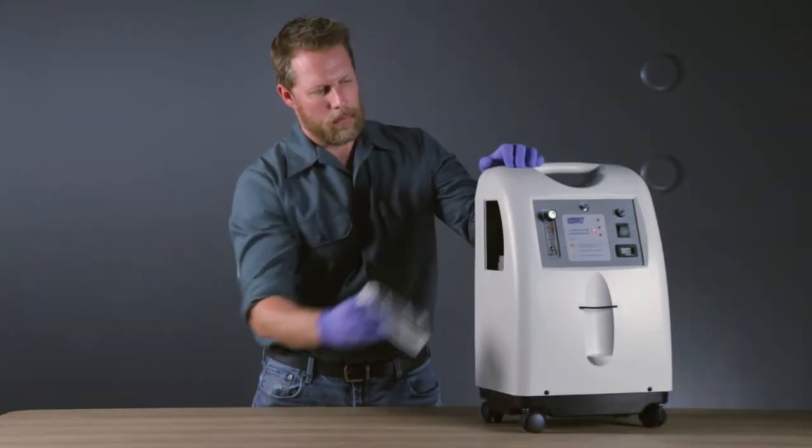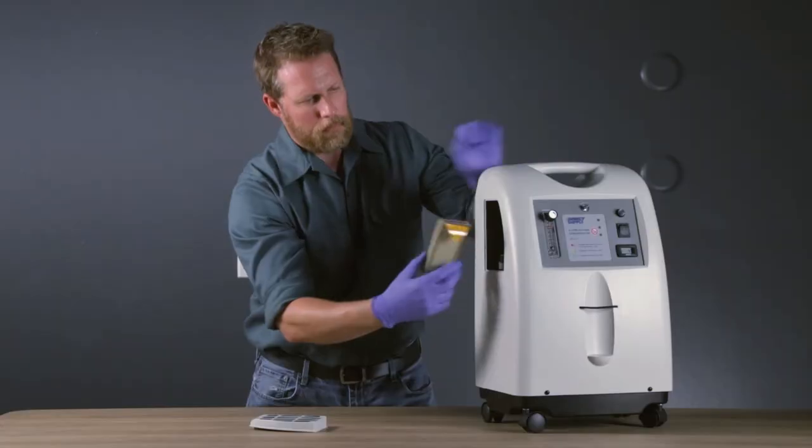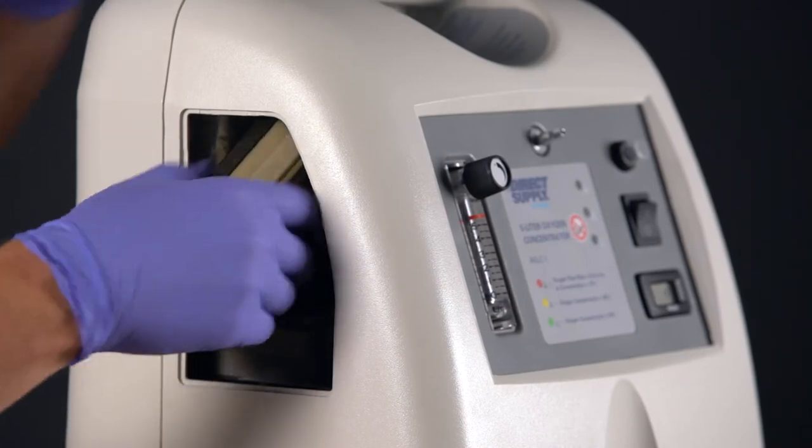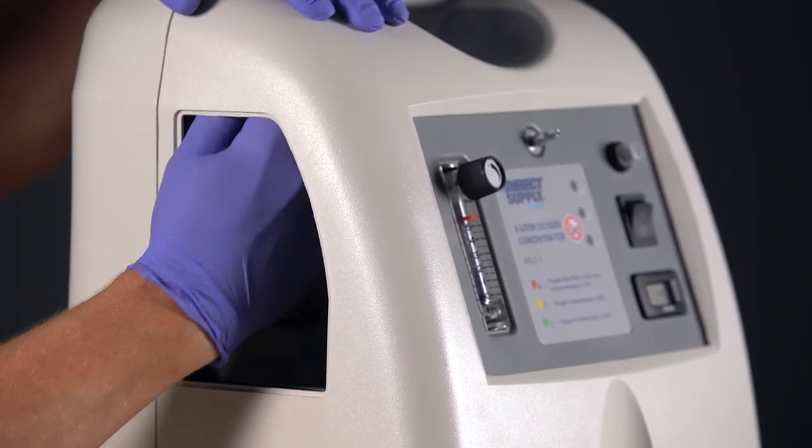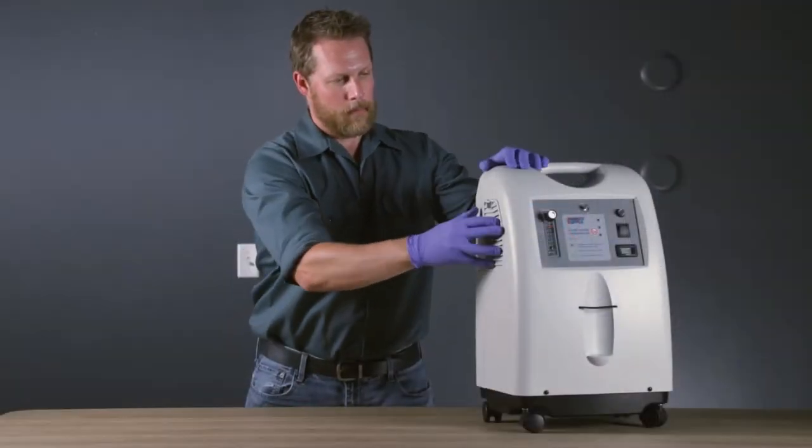Remove the access door on the left side of the concentrator. Take hold of the filter and lift up while using a twisting motion. To install a new filter, insert the plastic tube on the filter into the rubber fitting. Press down and twist until the filter is fully seated. Reattach the access door.